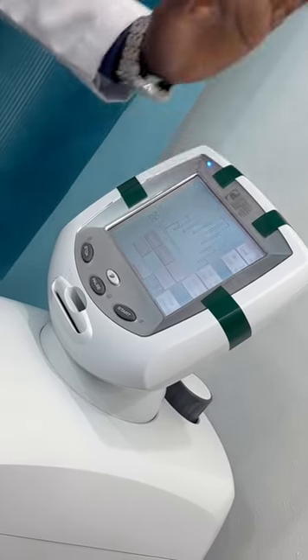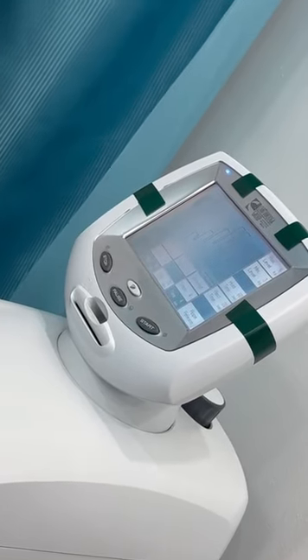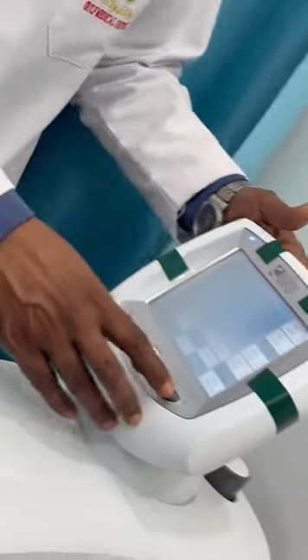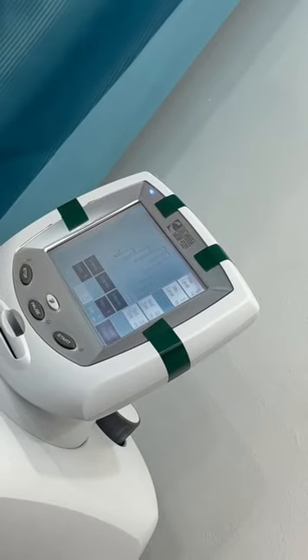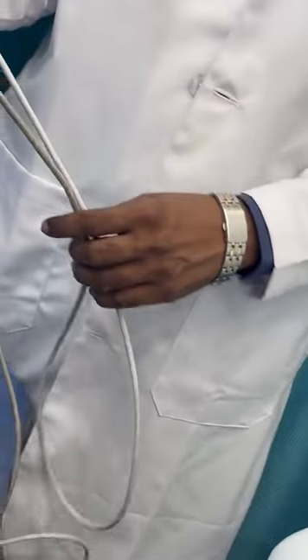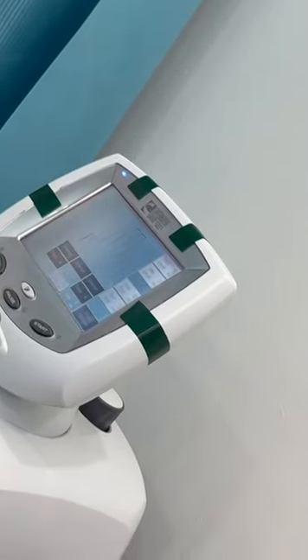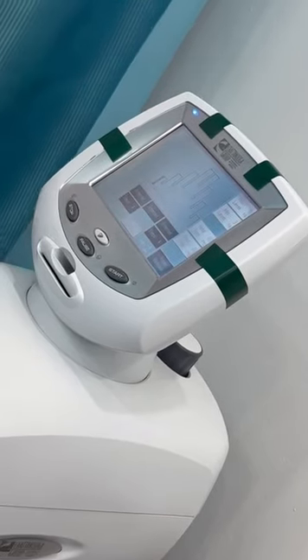Then you can set everything, fix it with the patient, and just click start. Then give this one to the patient. If at any time the patient has discomfort, ask the patient to stop with this one. And you are not supposed to go away from the patient, you have to be there with the patient for long. Sometimes the patient will sleep.